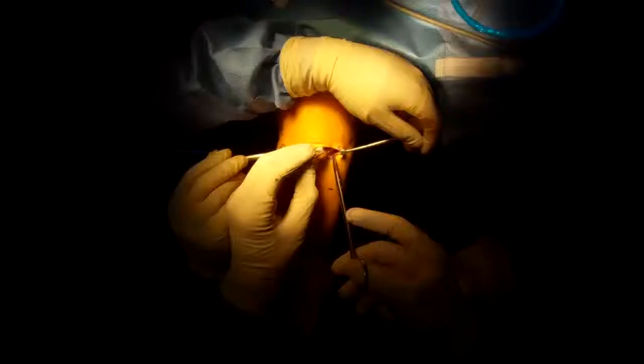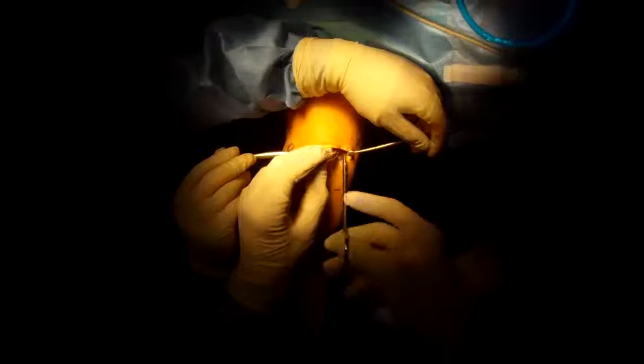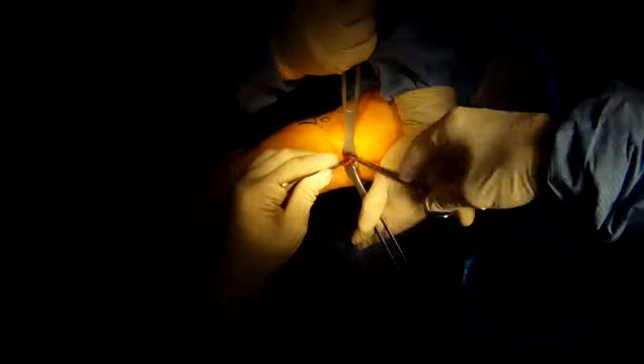I'm going to show you an inside view, the endoscopic view. Again I use a special knife to release the tissue that is otherwise scarred into and compressing the ulnar nerve. And I just check to make sure it's free.